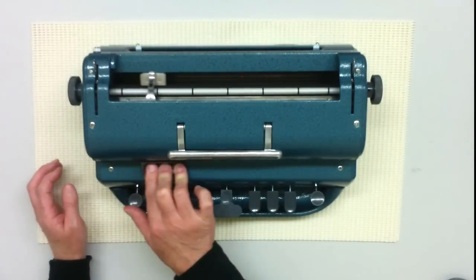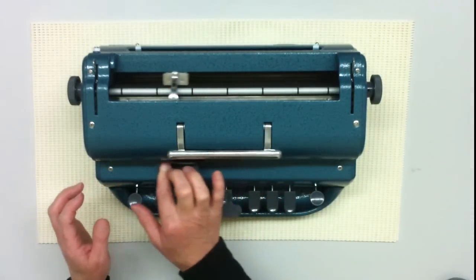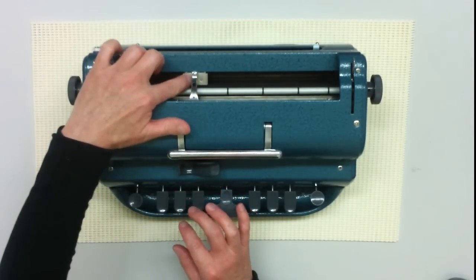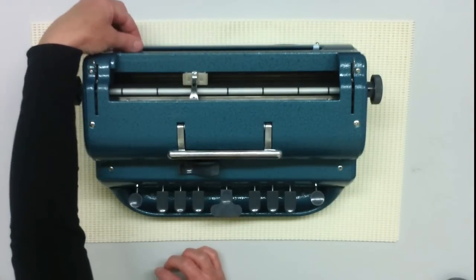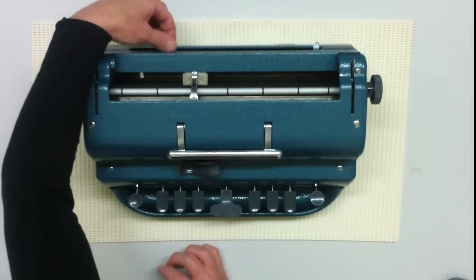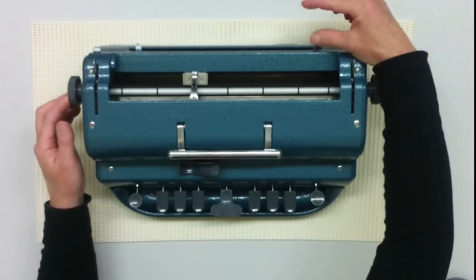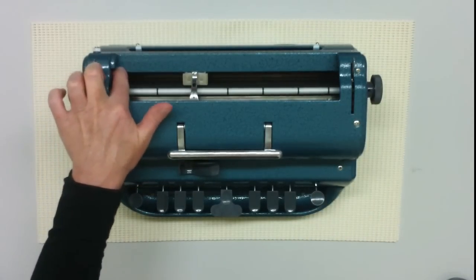There's a cursor lever which I can use to push the cursor across the page and back again. And here is the cursor. Underneath it is a cursor plate. I've got a left margin button which I can grasp by pinching it and push it to change where the margin is, and there's a right margin button. Again, I can pinch it, grasp it and push it. And over here is a paper sensor.